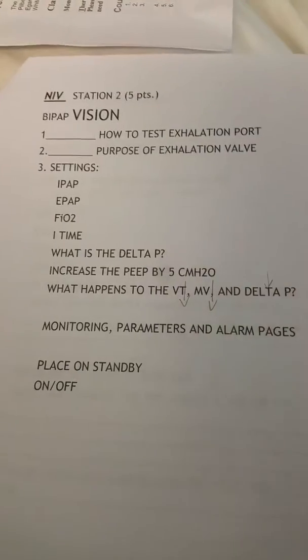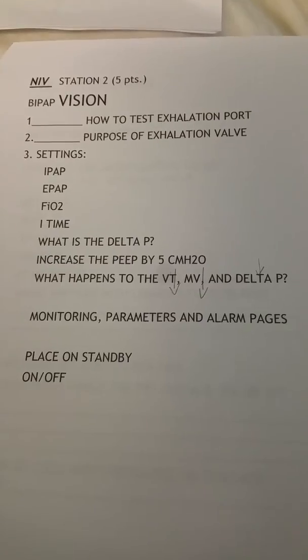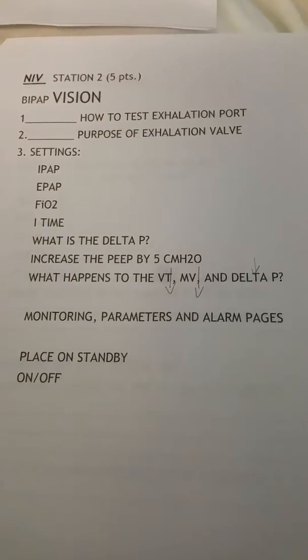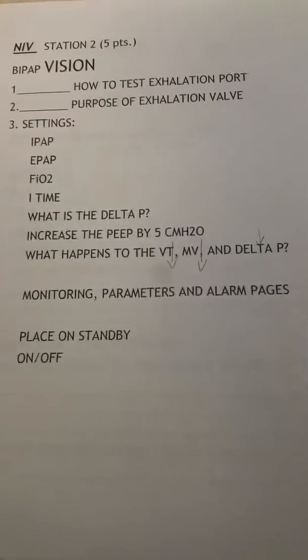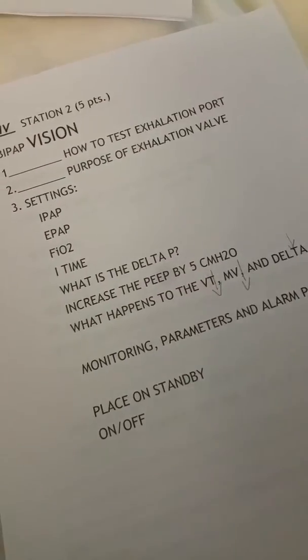What's the IT? High time? Oh, the I time. Okay. Yeah, and that's on the V60. But I time just means inspiratory time. Yeah, and you'll see that a lot.